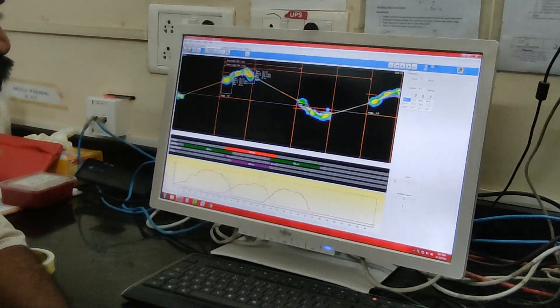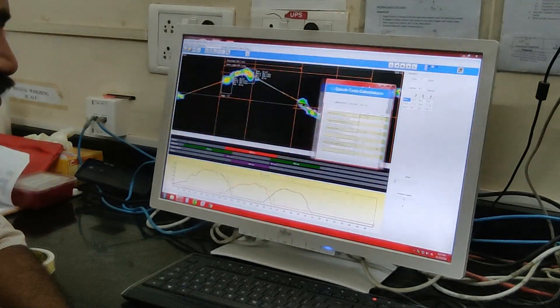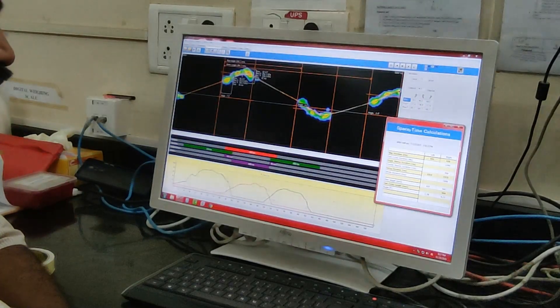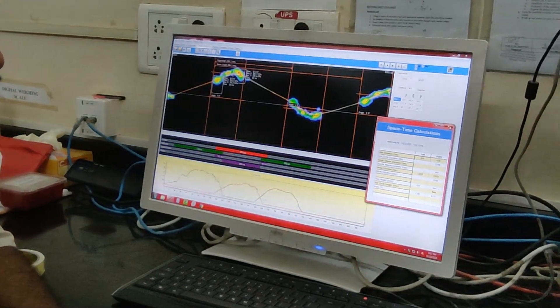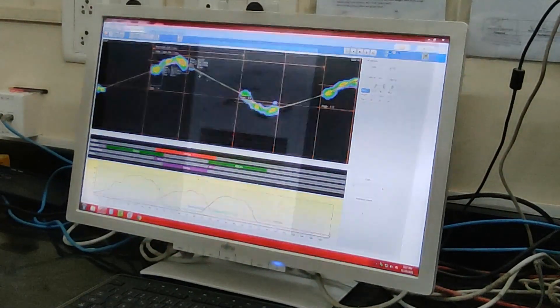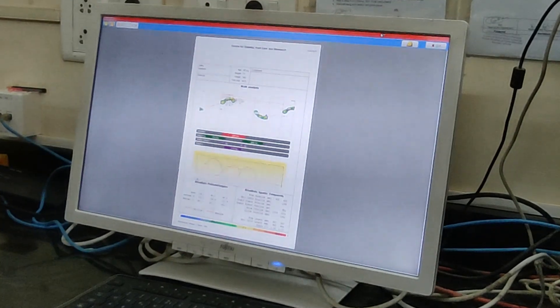These forces are taken in both dynamic — that is gait or walking — and static — that is standing with both eyes open and eyes closed. The software can also detect the sway in the COG, that is center of gravity, and it can be compared across eyes-closed and eyes-open conditions in people with balance issues.